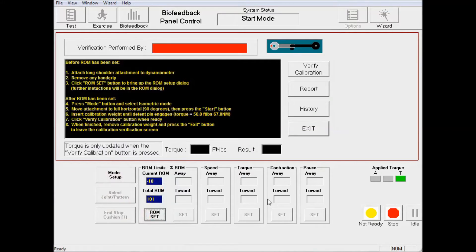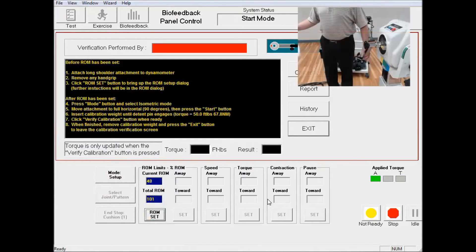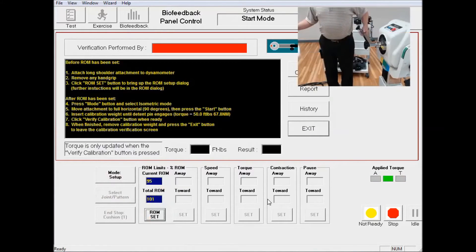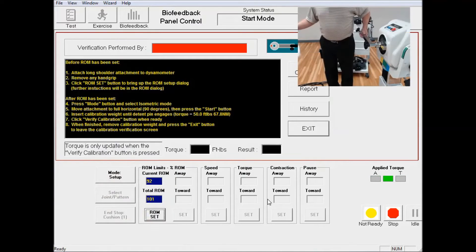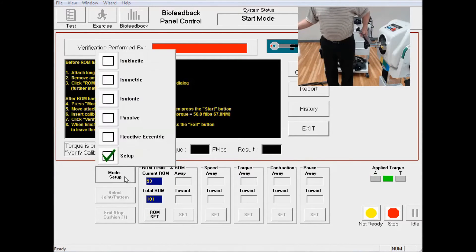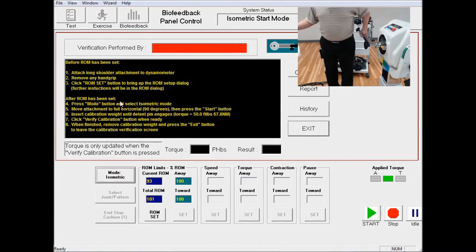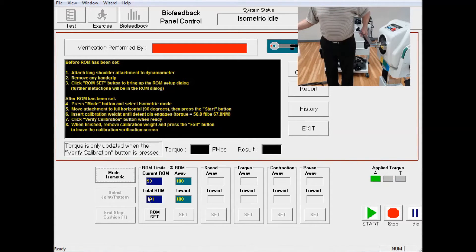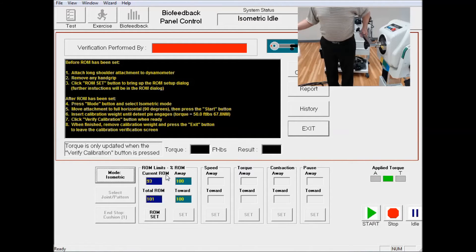At this point, we're going to raise the attachment up. You're going to click the Mode Setup for Isometric, as in the directions. We're looking for 90 degrees on the current range of motion, right here.